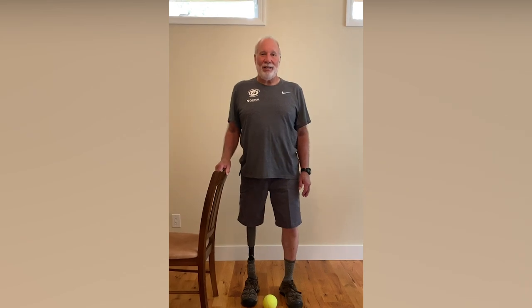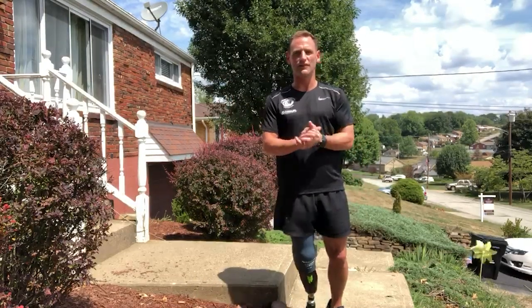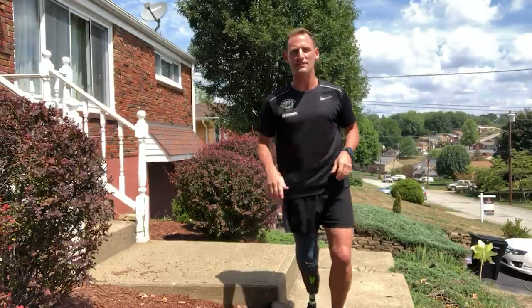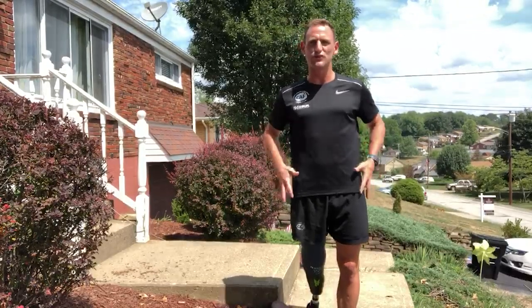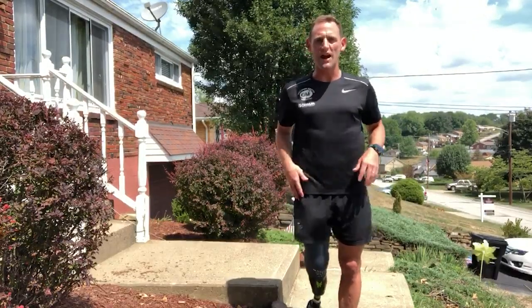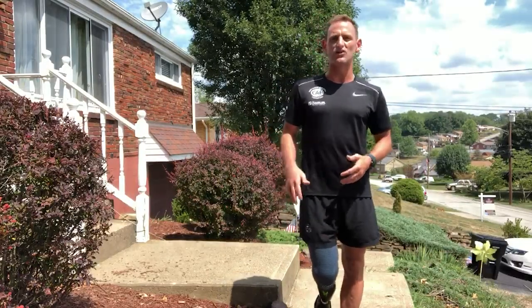It's an amazing exercise. Hello, my name is Eric, and I'm happy to run us through some agility exercises today. We do these agility exercises in order to build strength, to maintain strength, to build and develop coordination, to get us used to being in our socket.